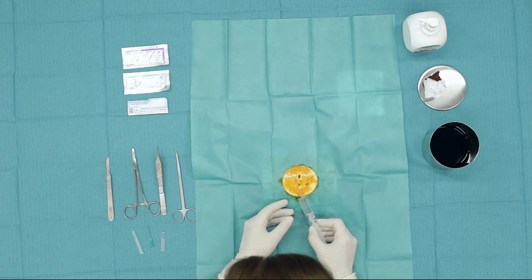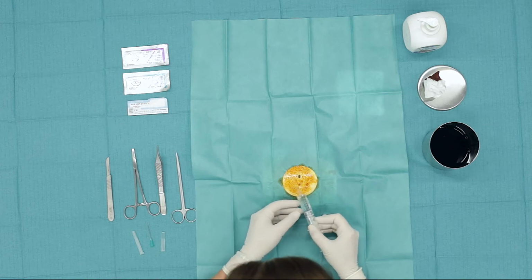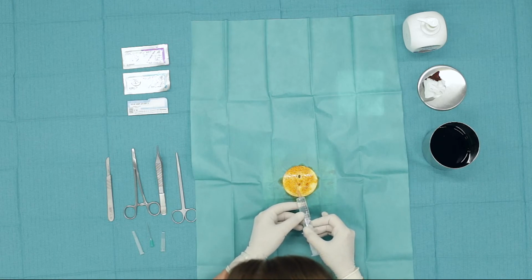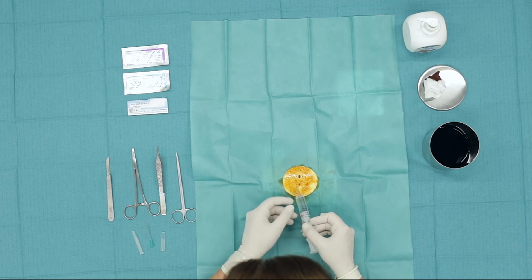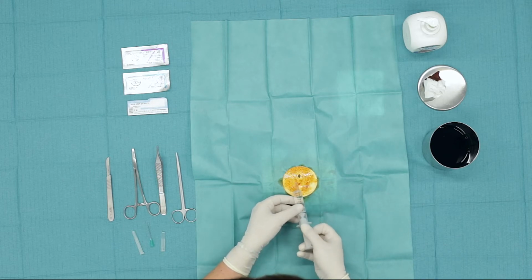This means that in order to cover the whole surface anesthetically, we will puncture again from this point where the anesthetic has already been administered, and we will proceed in parallel, again with a 45-degree angle, suction and administration of the preparation with parallel withdrawal of the needle.